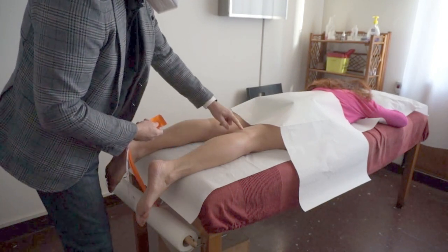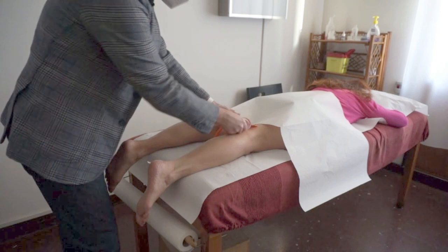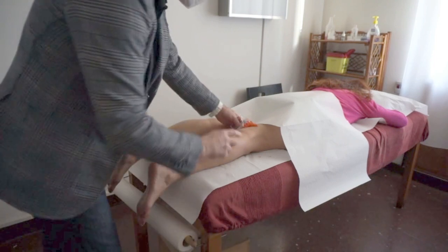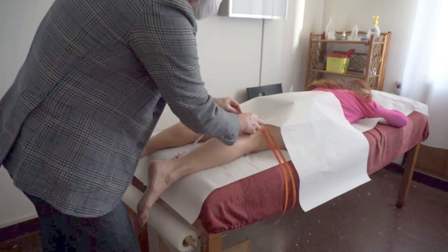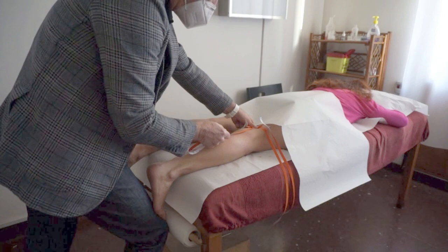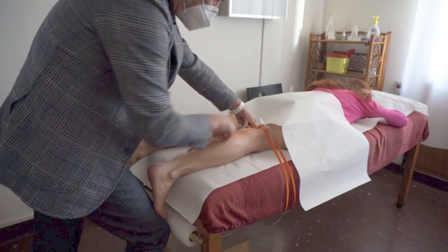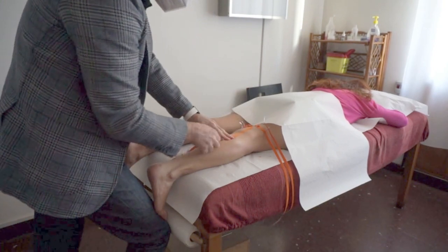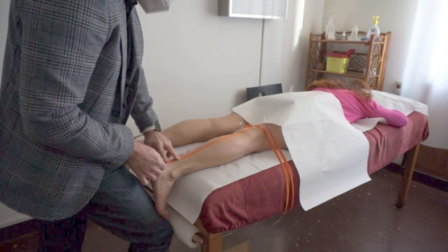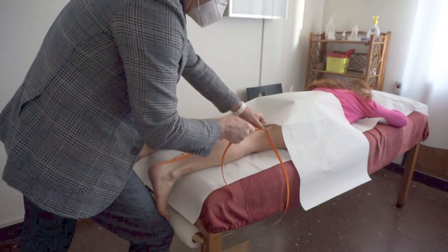The different widths of the tape have different therapeutic objectives. The wider the tape, the deeper the action and the more functional action it will have over the muscle and joint areas. Tape cut to 1 cm wide is the basic lymphatic objective, because 1 cm wide tape works at 1 cm depth — so we're talking about superficial lymphatic drainage. Tape can also be cut at 5 mm or 6 mm, which has a vascular objective at a capillary level.